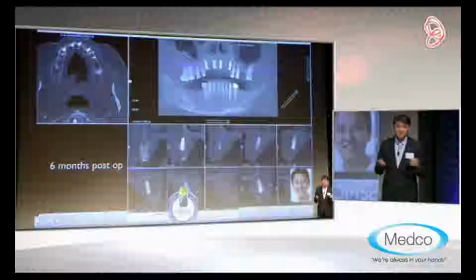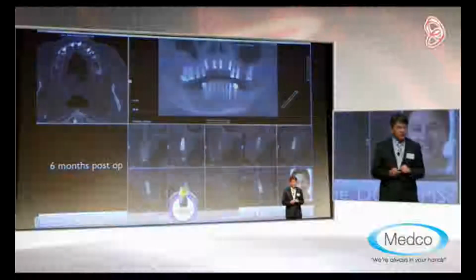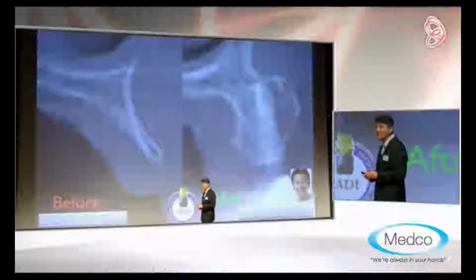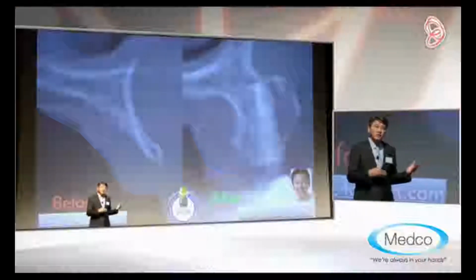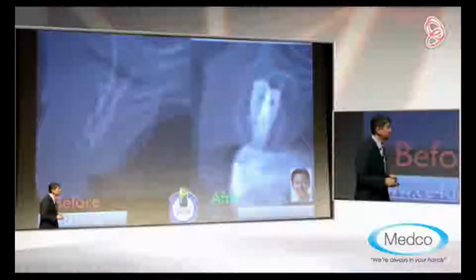So as you can see, 6 months is very disappointing because you will not see a lot of bone around dental fixture. But when you wait about 12 months, you will find a lot of bone around these fixtures. As you can see on your left, before we have 1 to 2 millimeter thickness of the bone. On your right, I have more than enough bone for the fixture. Only downside is because it looks like a sponge bone, I had to go back and trim the excess bone. But it's a good problem to have, as you can see, when patients have deficient bone for our implant procedure.